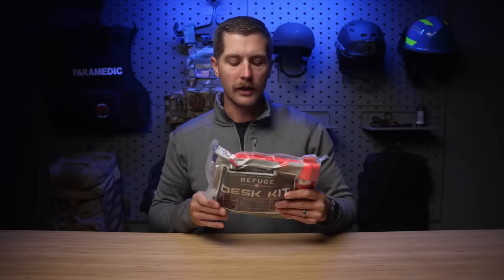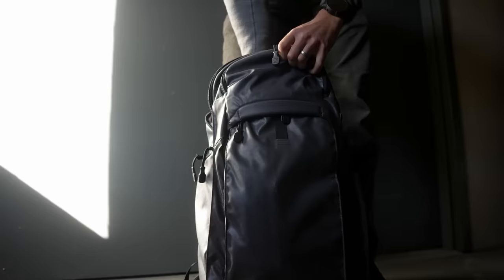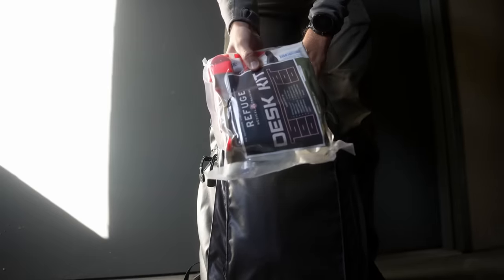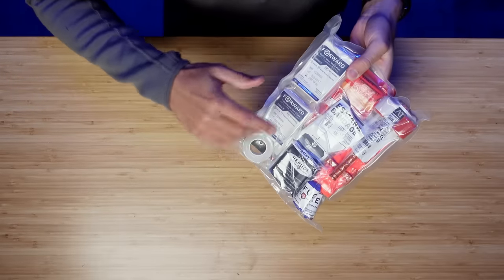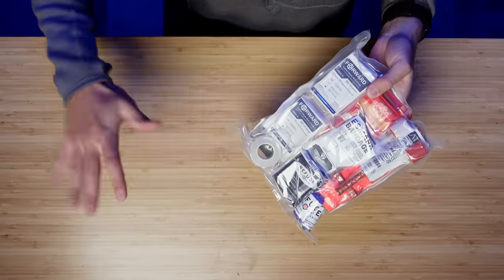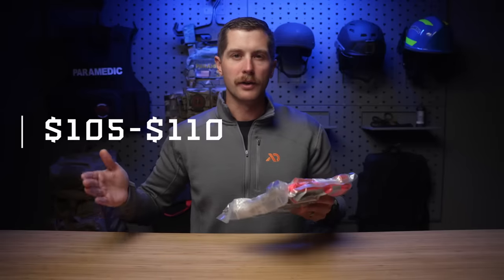I've done a number of reviews on their kits and this one is no different. So today we are going to go through this thing piece by piece and I'll tell you what I think. First and foremost, I claimed that this was cost-effective and I stand behind that. I added up all the contents in here and if you bought everything on its own, it would come out to be about $105 to $110. Obviously that's kind of an estimation because prices fluctuate, but it's a rough estimate on buying these things individually.